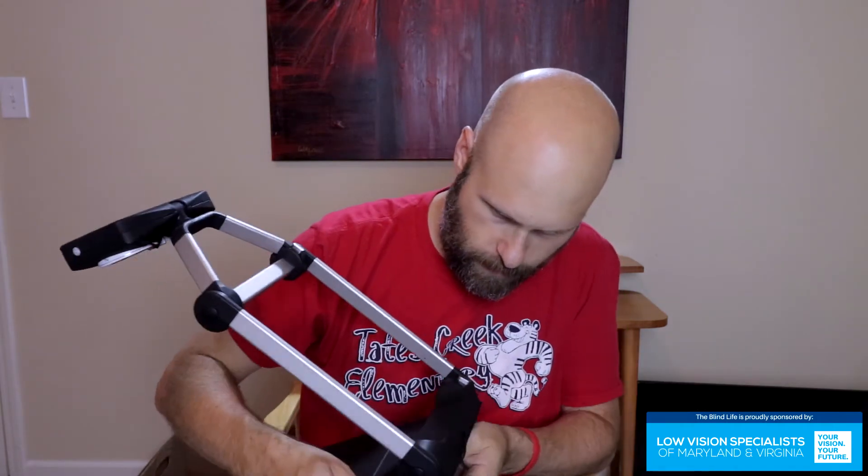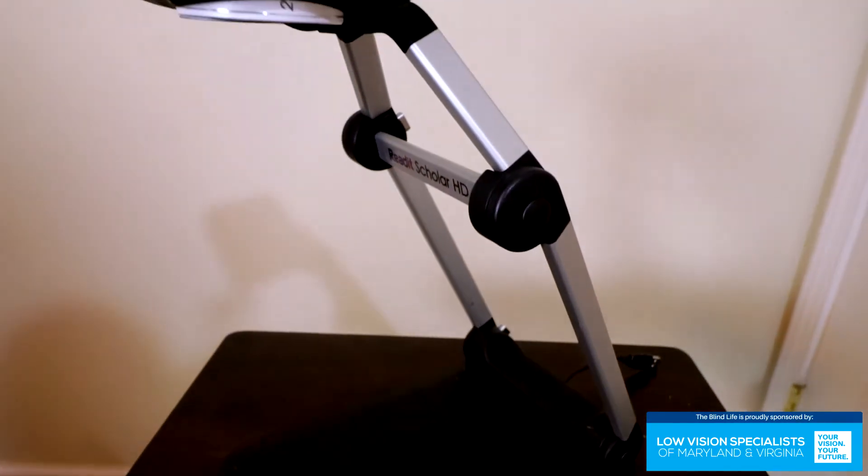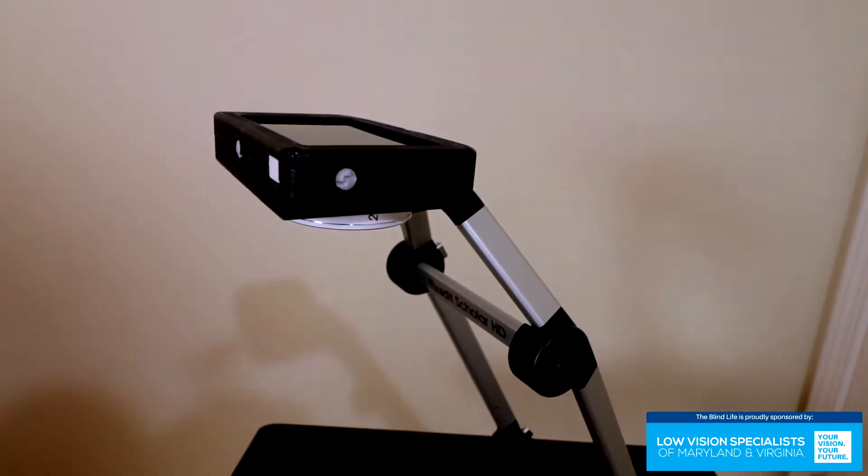It opens up like this. Let's put the bag down. The camera swings up and points down. This is how it sits on your desk — there's the cable. It sits perfectly flat on your desk with the camera right here.